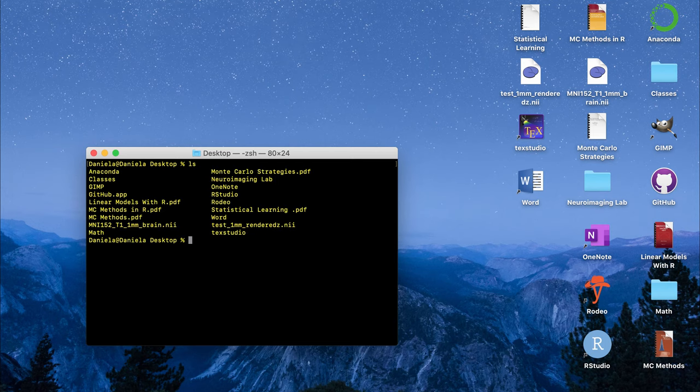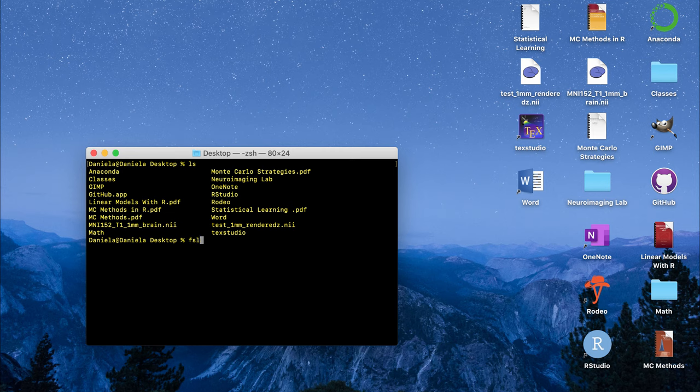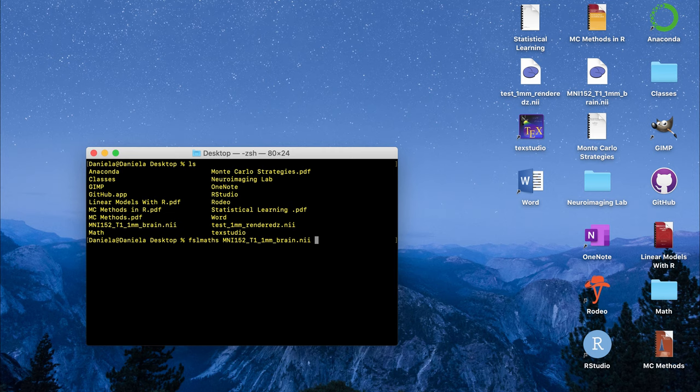To create a brain mask using FSL, it's very easy. There's a command in FSL called fslmaths which lets you do a bunch of different manipulations on different nifty files. I'm going to type in fslmaths as the first command then I'm going to pass in the name of the nifty file that I want to binarize or create a mask for, then I'm going to pass in the command or the flag -bin and then you pass in whatever name you want the output image to be called.